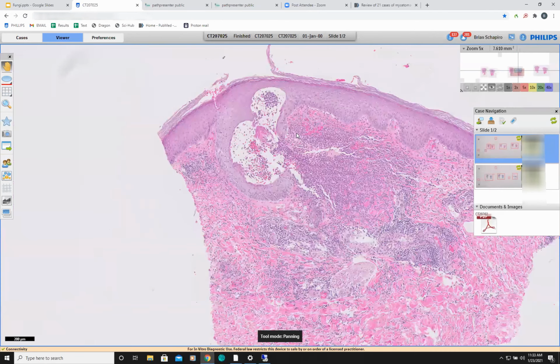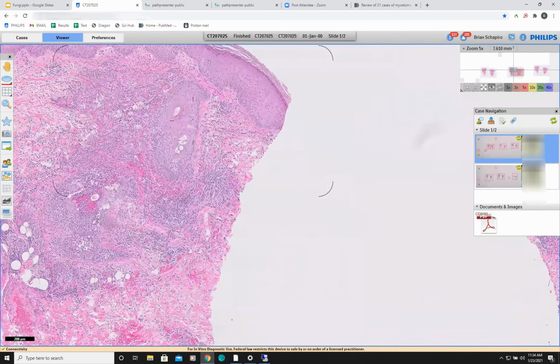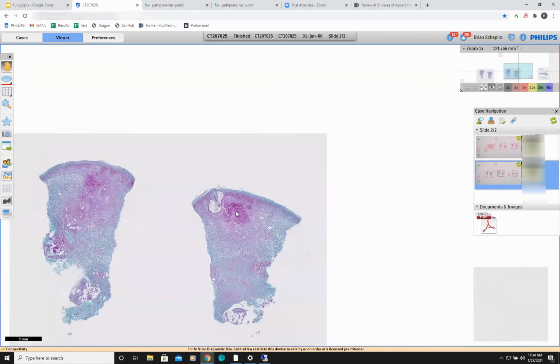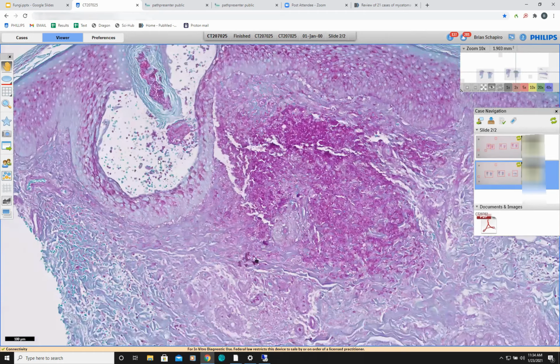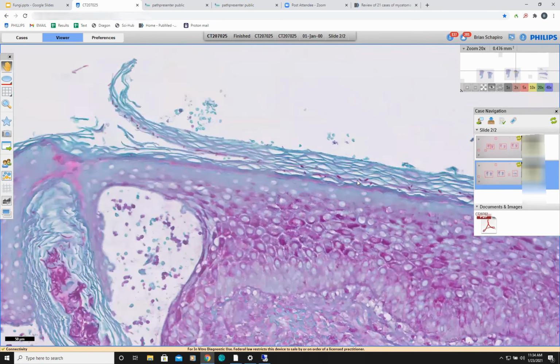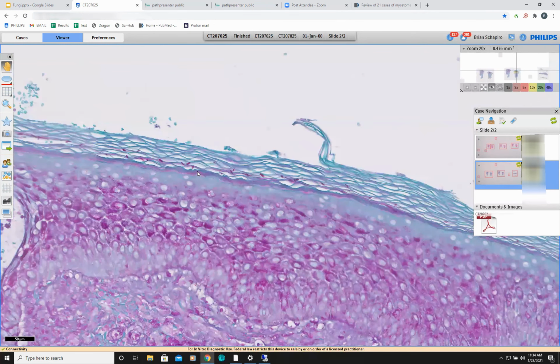And here's another case of endothrix. And this one was, again, a similar ruptured follicle with a folliculitis, but this one, we did a PASD stain. And here you can see the organisms in the epidermis. So sorry, this was a fungal folliculitis.